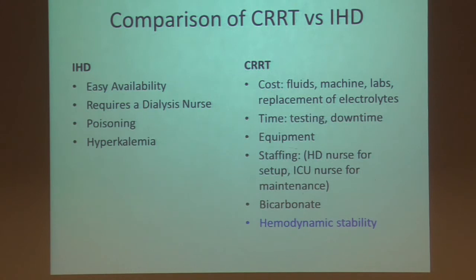And I'd say it works out pretty well most of the time. But remember, the bigger question is, does this person need dialysis or not? That's a different situation. That's the bigger picture. But we can dialyze almost anybody. These machines are awesome. Just real quick, again, just to touch base, regular dialysis machines are almost available everywhere. We call the dialysis nurse.